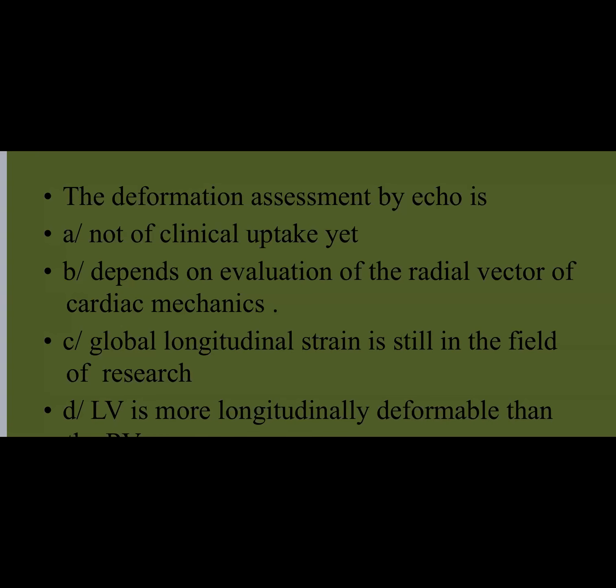So the deformation assessment by echo is, yes, let me mute everybody. Okay, so deformation is another way of saying strain and strain rate. So the deformation assessment by echo is of no clinical uptake yet. So it has no clinical utility so far.